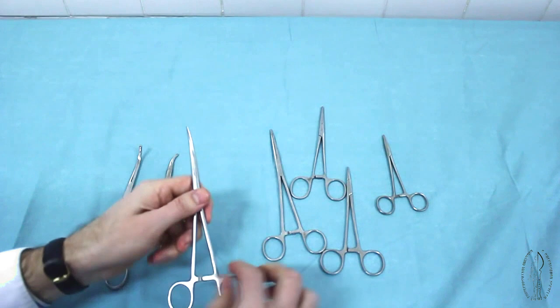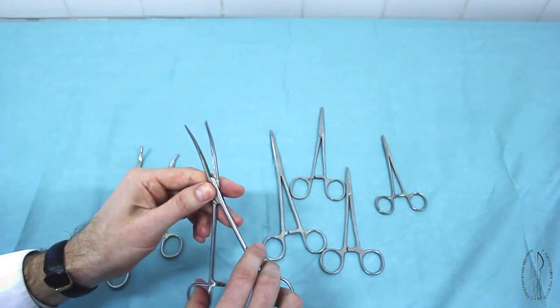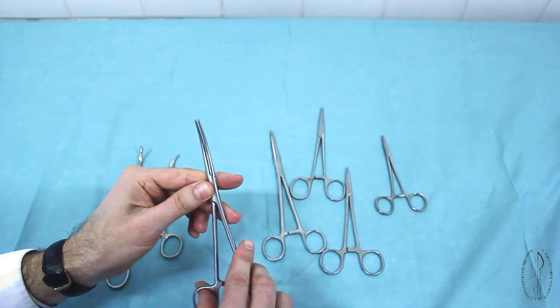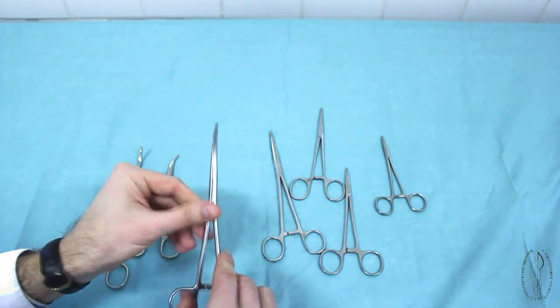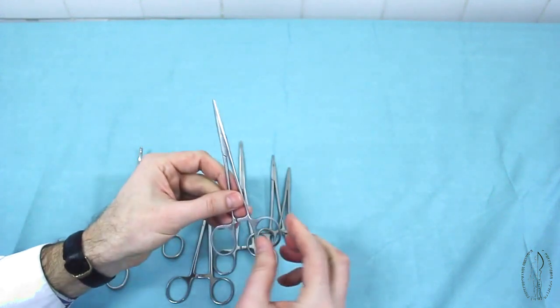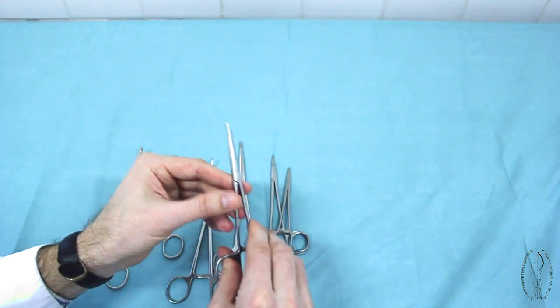Hemostatic instruments without teeth at the ends of their branches are called Billroth forceps. Hemostatic instruments with narrow, thin branches, allowing catching small vessels and soft tissues, are called mosquito forceps.